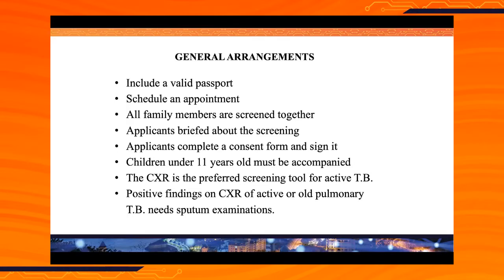Applicants are going to be briefed about the screening, and they have to complete a consent form and sign it. Children under 11 years old must be accompanied by a parent or a guardian. The direct digital chest X-ray is the preferred screening tool for active TB diagnosis. A positive finding on chest X-ray of active or old pulmonary TB will need 3 sputum examinations to get results.